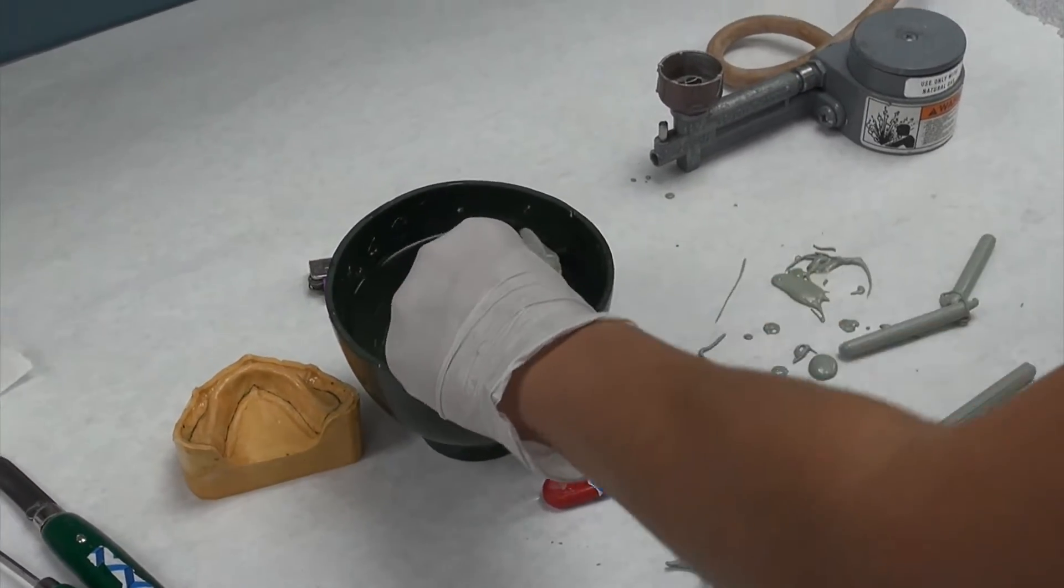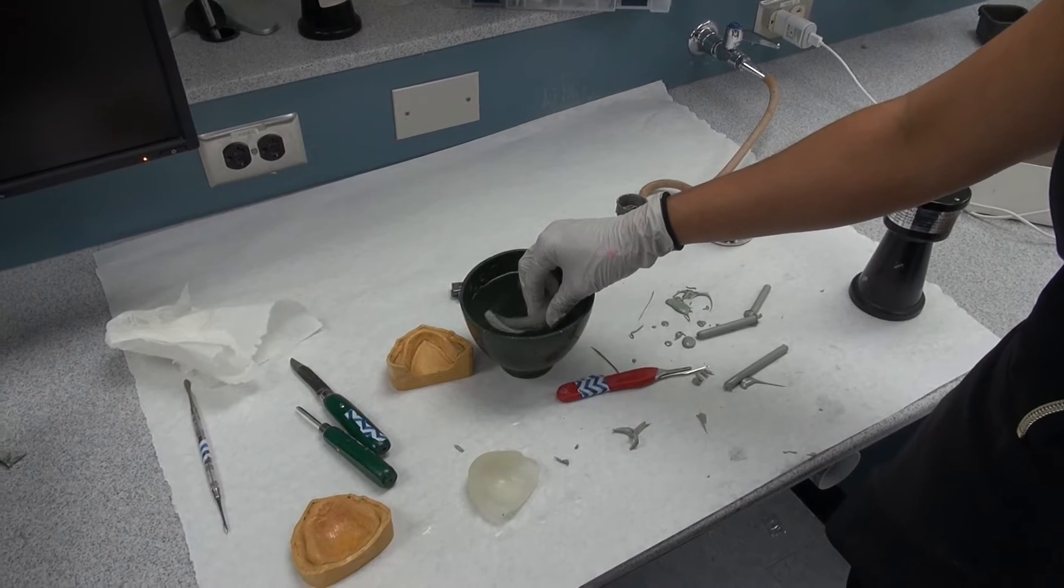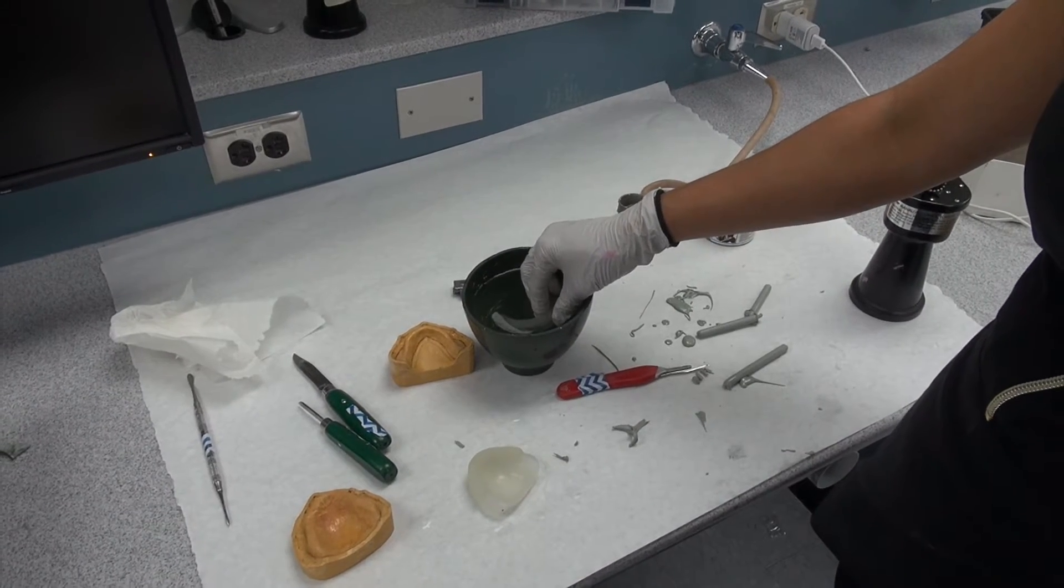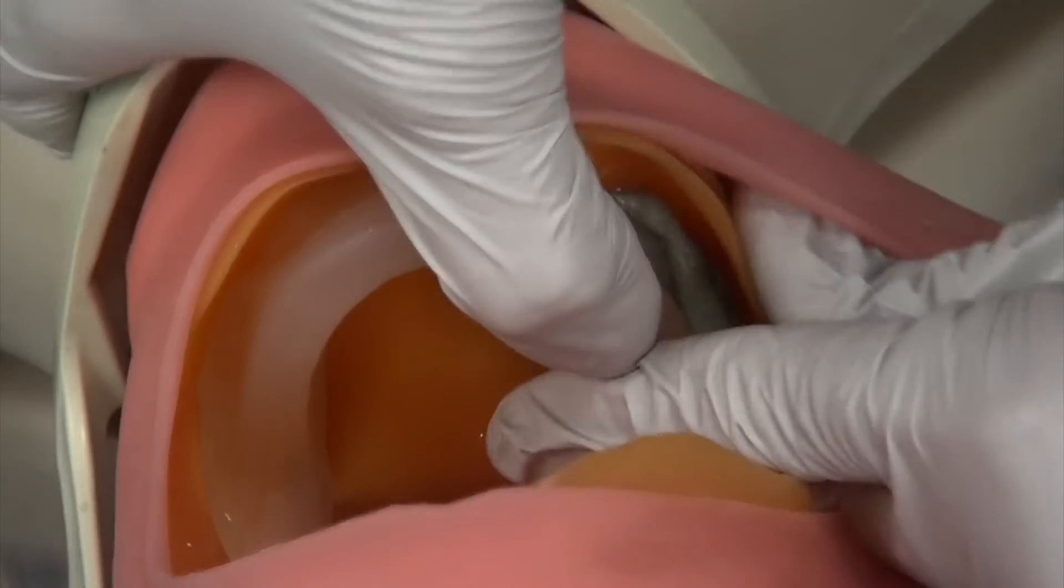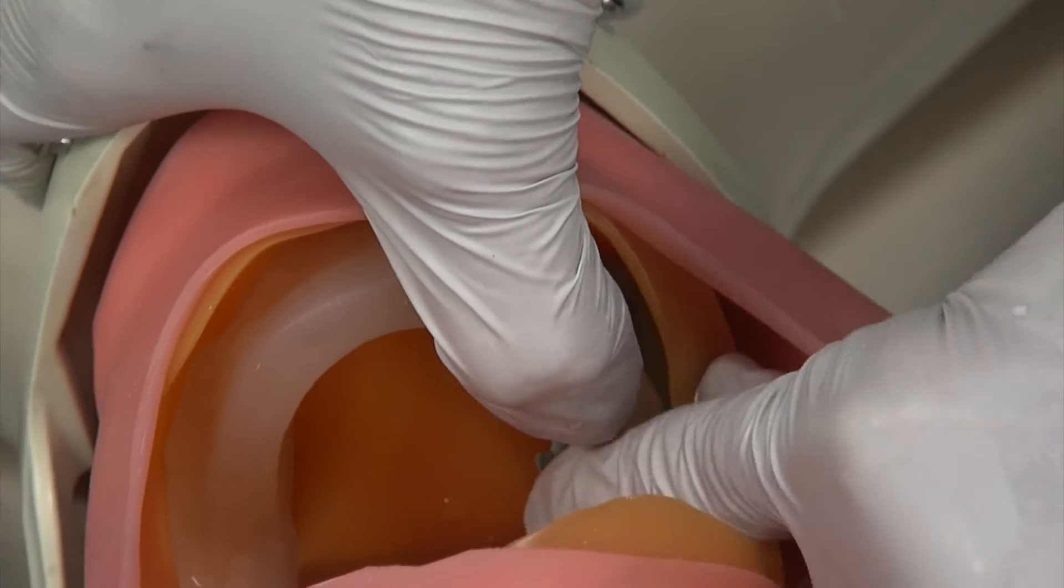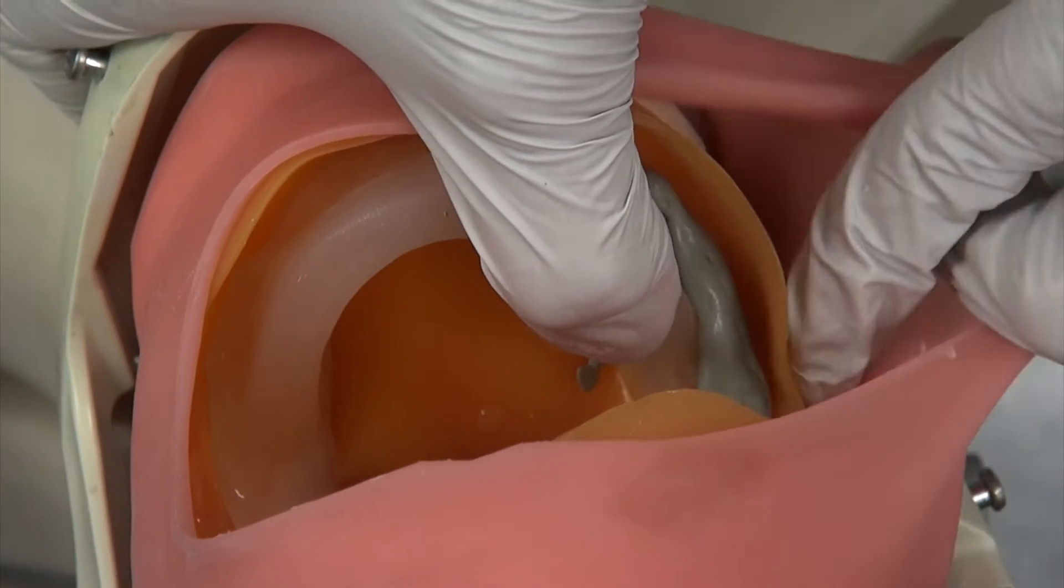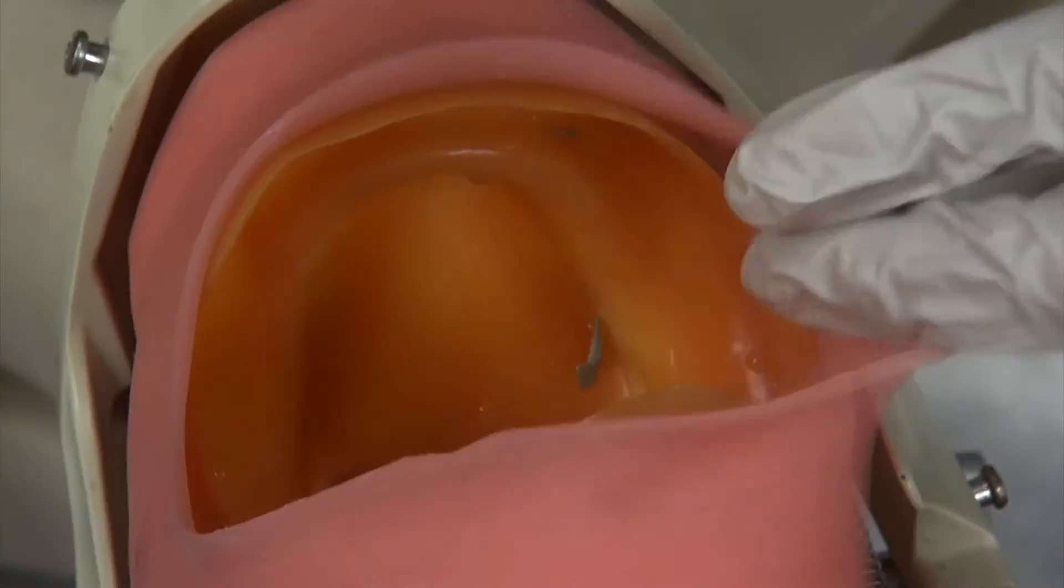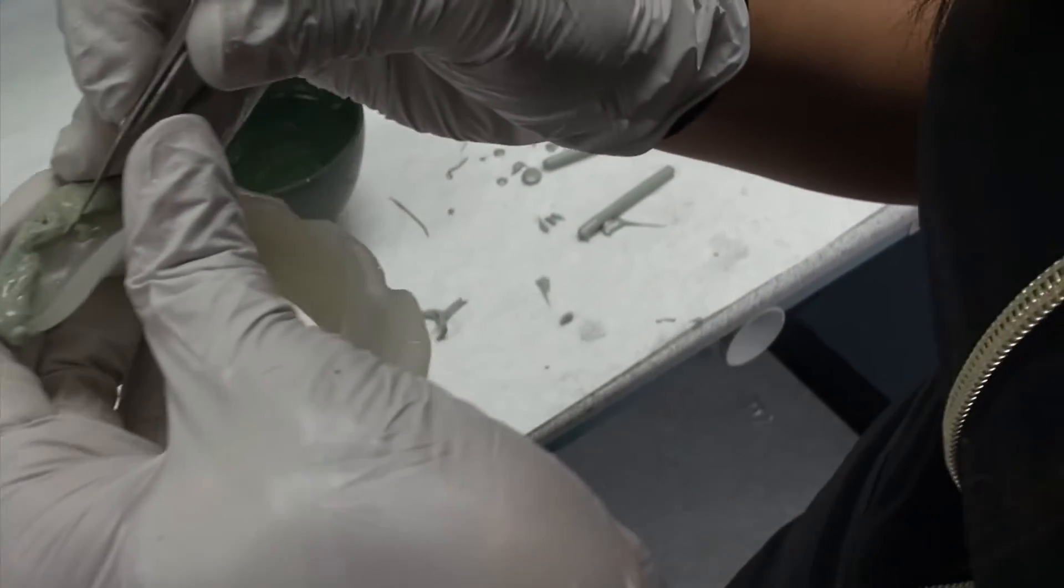Okay, so it really just becomes a back and forth. We're going to put it down again, applying a little pressure. You can pull it out. And so any of this excess can be taken off.